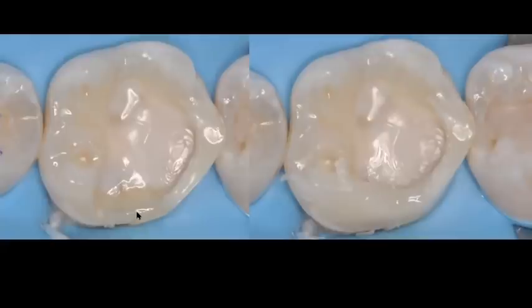So this helps you reduce that polymerization shrinkage that we know occurs every time you polymerize a composite, and that you cannot control effectively using a horizontal technique, because you just have too much composite and too many adhesive or bonded walls, or walls that you need to bond to. So now once we have encircled this restoration, all we have to do is think about that class 1.